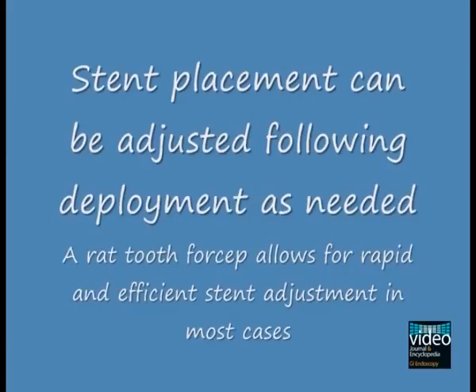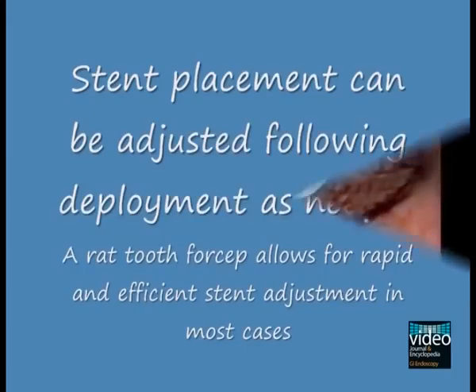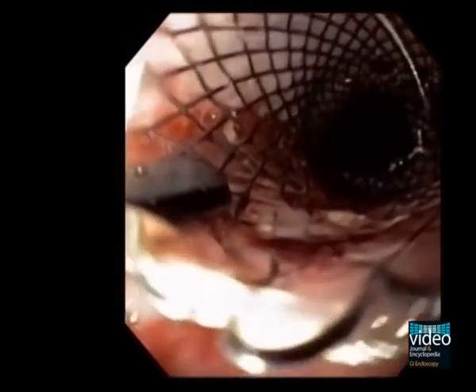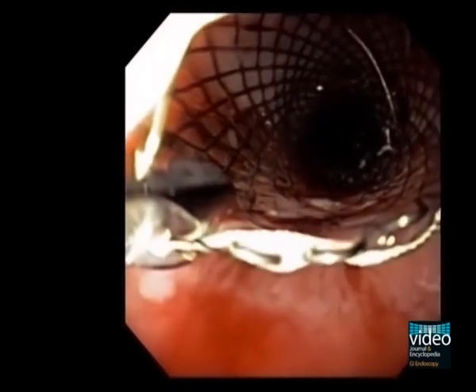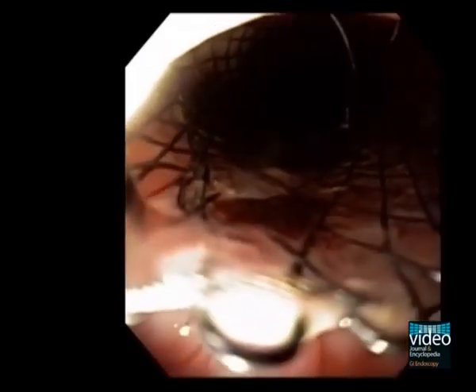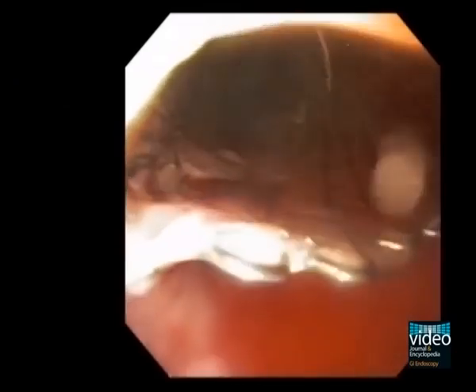Stent placement can be adjusted following deployment as needed. A rat tooth forceps allows for rapid and efficient stent adjustment in most cases. This video shows the use of a rat tooth forceps to proximally adjust the position to fully cover an esophageal stent. The stent is moved approximately 2 cm. When the stent is felt to be in adequate position, the rat tooth forceps release the stent and the position can be directly assessed endoscopically. If satisfactory, no other adjustment is required.